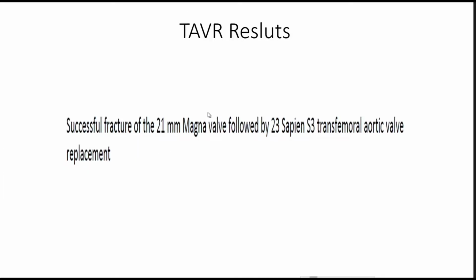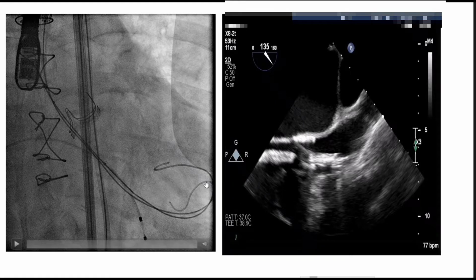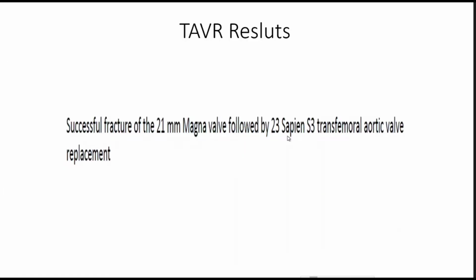So they fractured that valve. Yeah, they fractured the previous valve. So right, that's what they were doing, was fracturing the valve right here, and then we're able to put a 23 millimeter valve into a 21 millimeter previous valve.